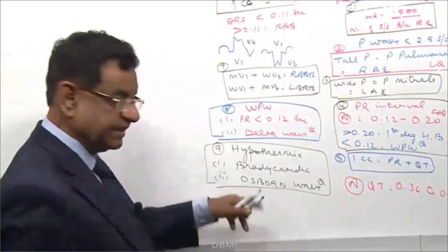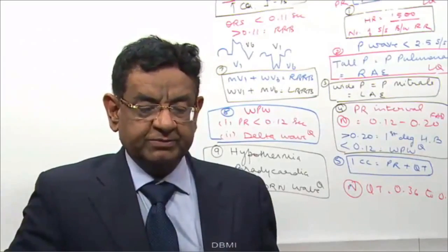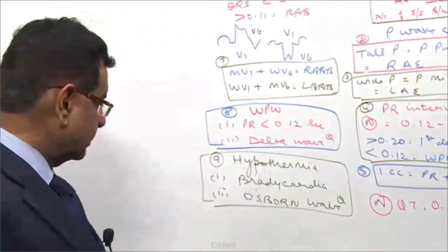Osborne wave was the latest question also in this year's exam. Okay, latest exam questions are Osborne wave also. This is hypothermia, a very frequently asked question.